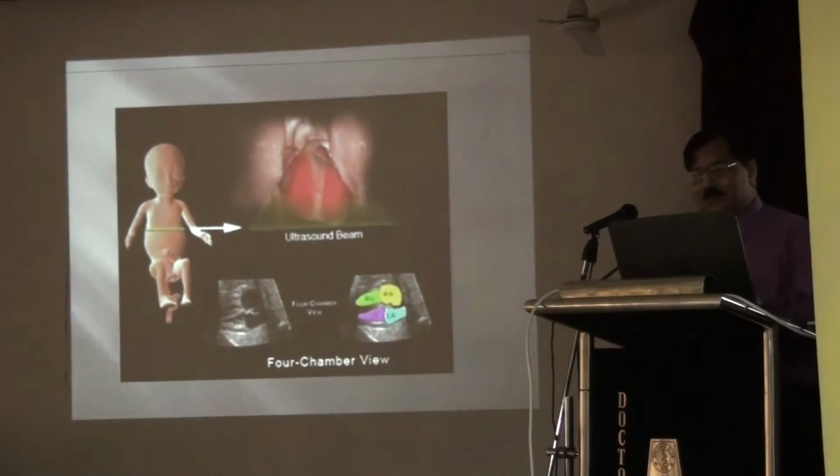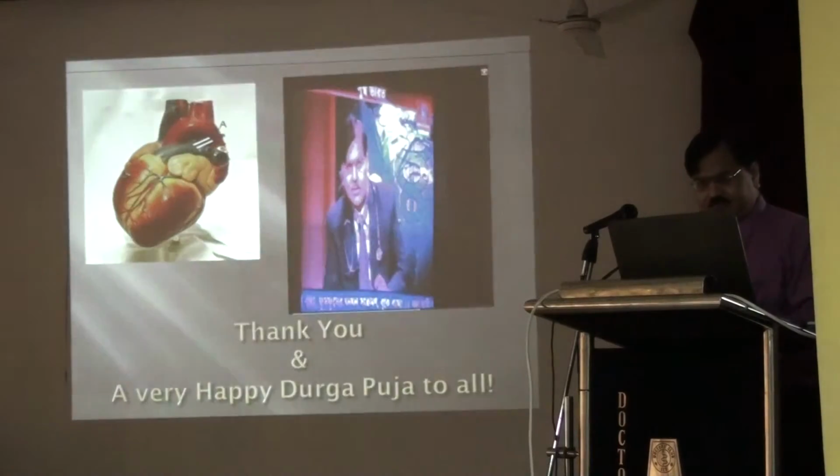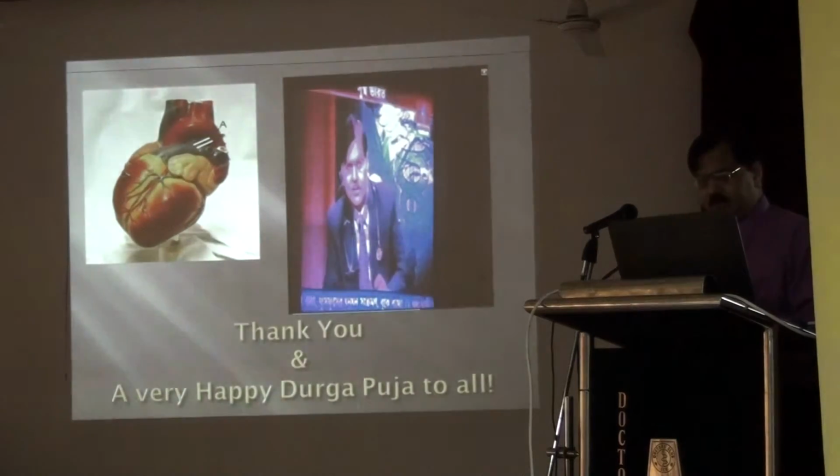Ideally, as I was telling you in the last meeting also, it has to be kept even in the ED, our emergency department, and ICU, as small tools, so that even in an emergency we can see it and at least get some basic ideas.